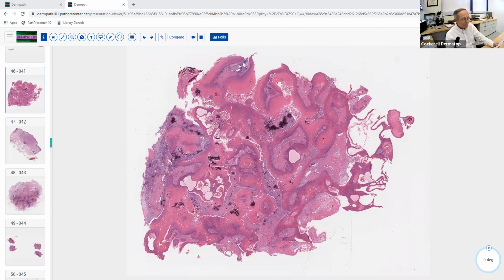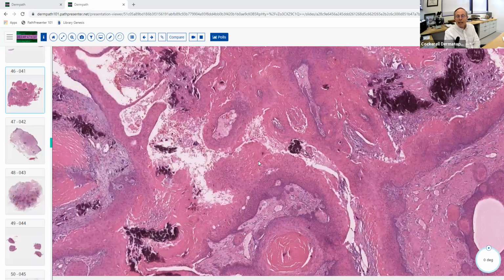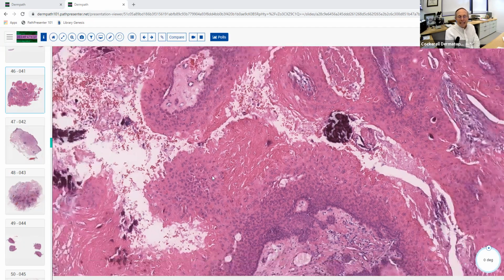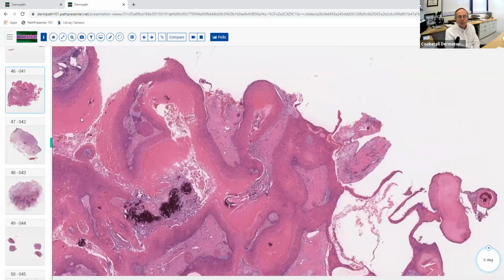That's an interesting typographical error. But anyway, the best diagnosis here, and you can see it's a neoplastic process. And go to higher magnification. It's got all of these bulbous aggregations of keratinocytes with this pink hyaline material. And this is what we call tricholemmal cornification. So this is the type of cornification you see with a pilar cyst, if you will. The problem here is that you've got massive areas of this bulbous pseudoepitheliomatous hyperplasia associated with this.